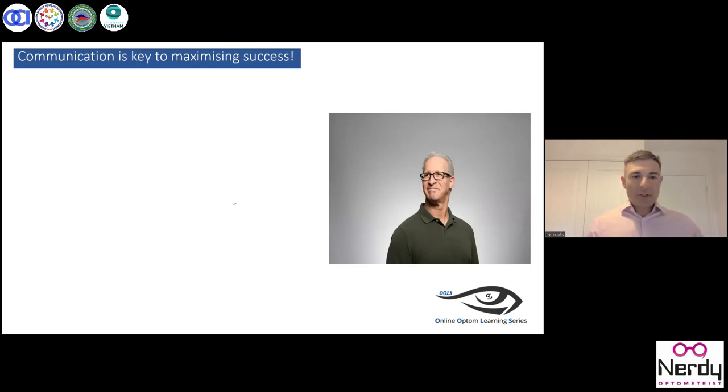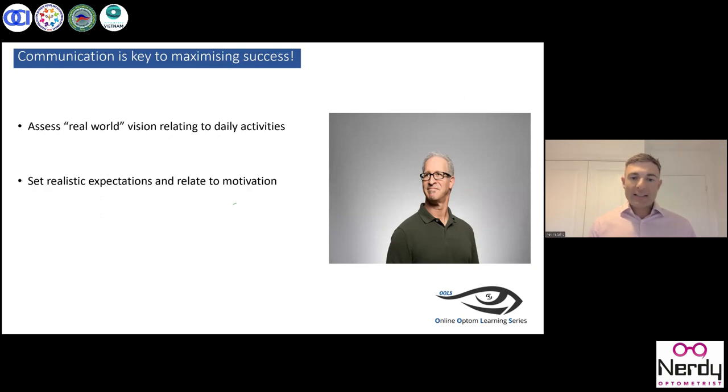Okay. So what we do know, obviously, with multifocal lenses, communication is key to success. So we need to relate things to real world vision rather than just what they can see on our testing charts. And that might be asking them about how their vision is during certain tasks, for example, driving, when they're using their laptop, their smart devices, and understanding. Try and set realistic expectations.